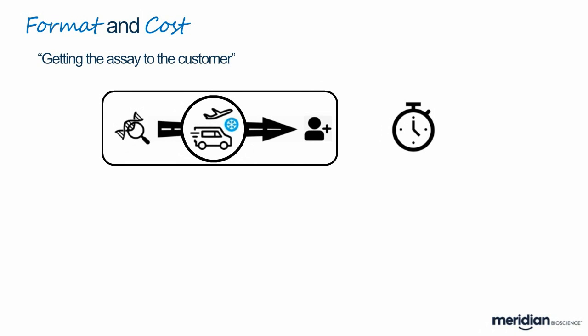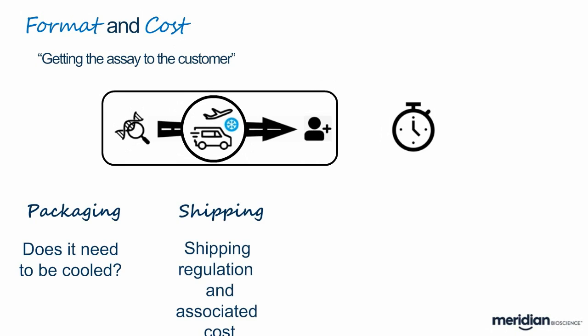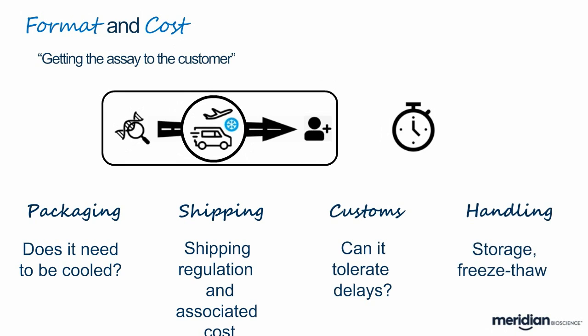The other two challenges I mentioned are format and cost. These two factors are very important when considering how you will get the assay to the customer. For example, do I need to cool my packaging? Will there be extra shipping costs for dry ice? Will my kit survive if delayed in customs? How can my customers store and handle the product to get the most out of it?